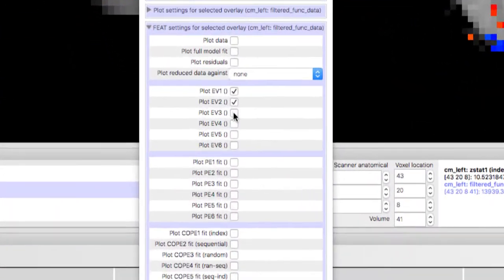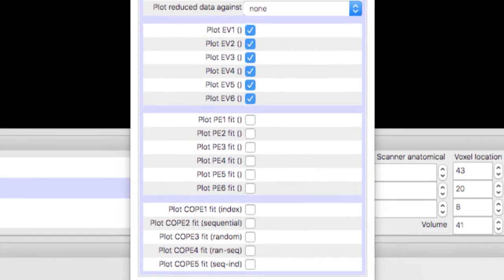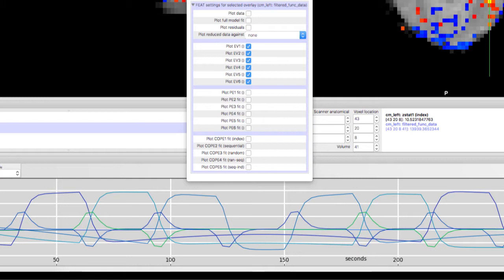Now add the rest of the EVs. When we estimate a model, each of these regressors will be scaled to best fit the data. That is, each of these regressors will be scaled and then combined to form a fitted or ideal time series that is compared to the time series at each voxel.